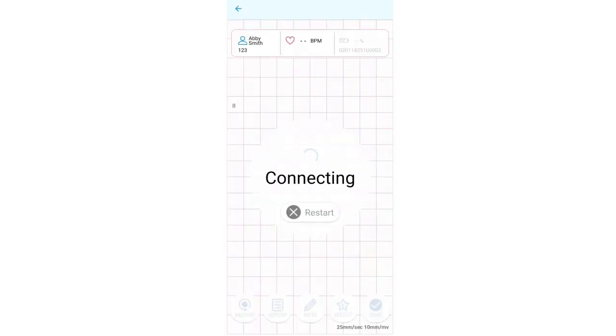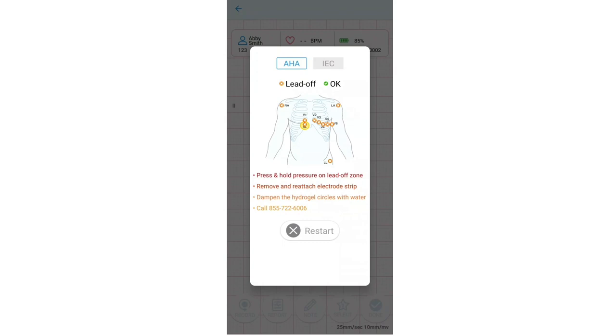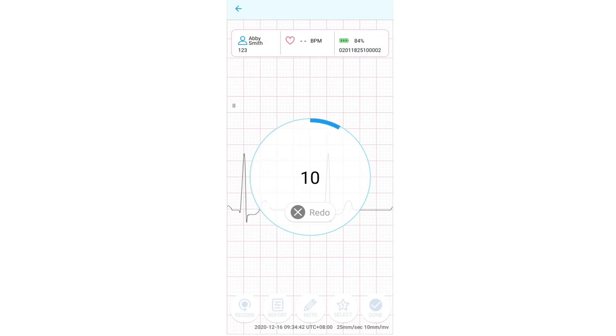The app will automatically scan, connect with PCA 500 recorder, and initialize recording. This screen displays the status of the leads on the patient's body, which only shows when there's a lead off error. If the lead icon shows lead off, please follow the on-screen troubleshooting tips. When troubleshooting is successful, the app will automatically continue recording a 10-second ECG.